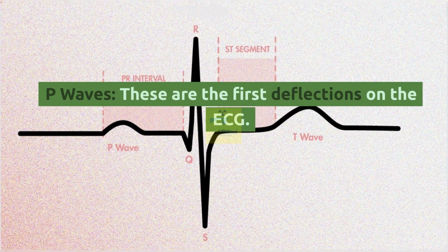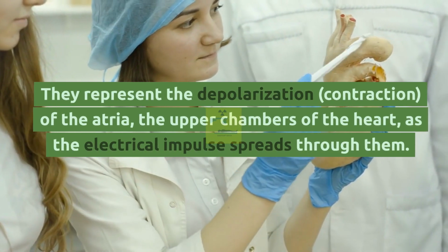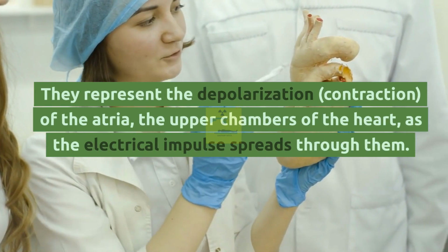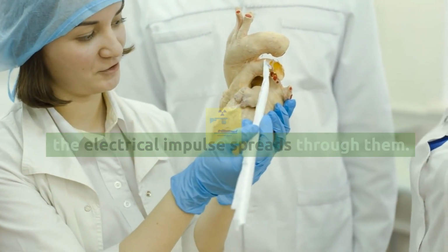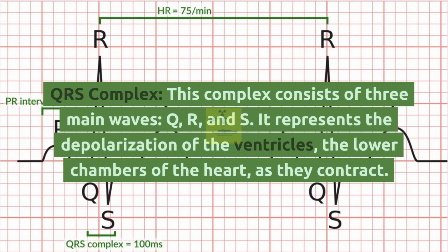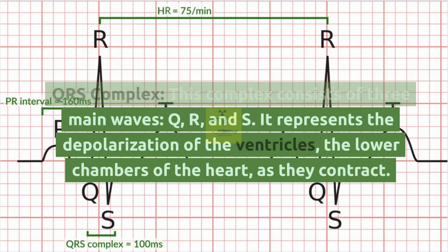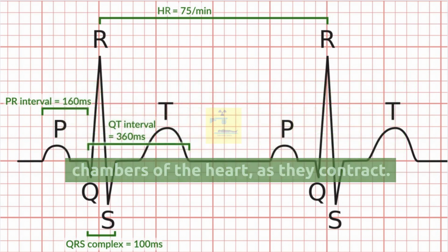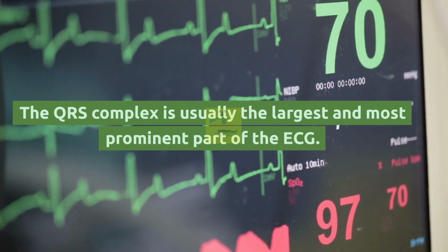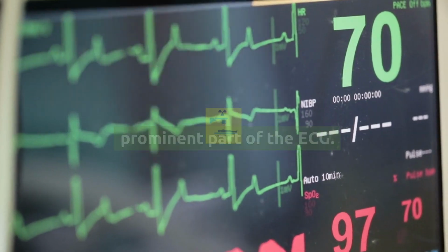Components of an ECG. P waves. These are the first deflections on the ECG. They represent the depolarization, contraction, of the atria, the upper chambers of the heart, as the electrical impulse spreads through them. QRS complex. This complex consists of three main waves, Q, R, and S. It represents the depolarization of the ventricles, the lower chambers of the heart, as they contract. The QRS complex is usually the largest and most prominent part of the ECG.